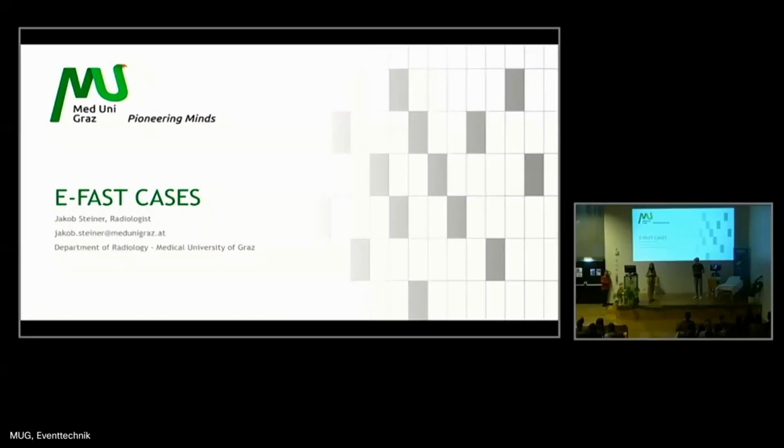But when you don't have this opportunity, normally you can repeat it. You can do it in 5 minutes, 10 minutes, 3 hours. It depends on the situation of the patient. So you need to talk with anesthesiology and just make an agreement upon the case. Okay.